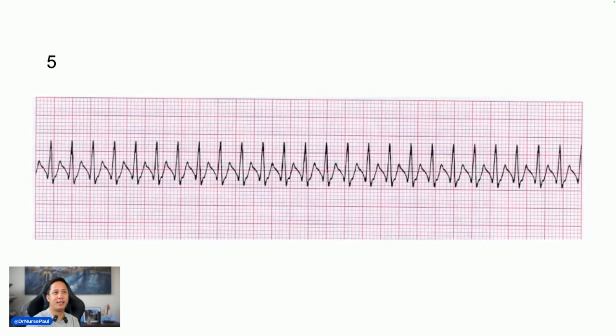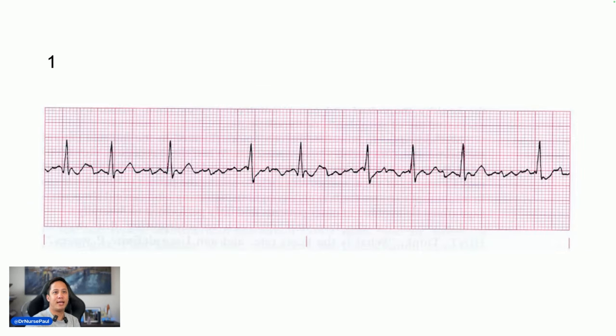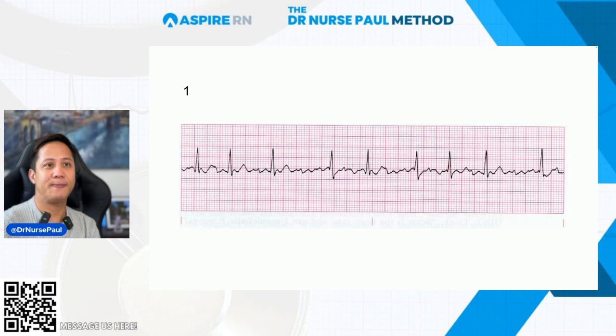All right, let's check your answers. Ready? I'm going to give you the answers. Number one is atrial fibrillation, right? Atrial fibrillation, all right? Very well. All right, so that's atrial fibrillation, everybody who got this correctly.